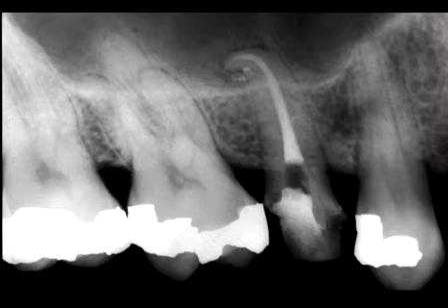Canal systems move through multiple geometric planes and curve significantly more than the roots that harbor them. The economy of the preparation is always a conscious balance between a canal that is three-dimensionally cleaned, shaped, and obturated, and conserving maximum root structure.